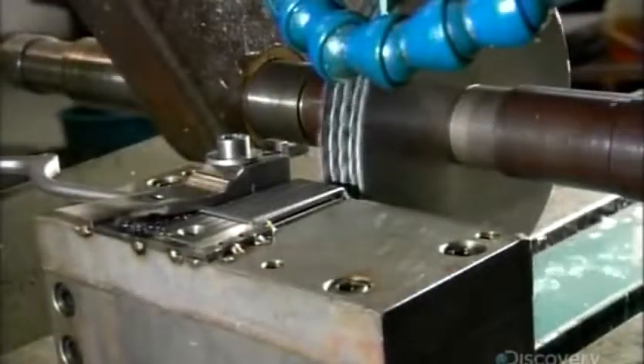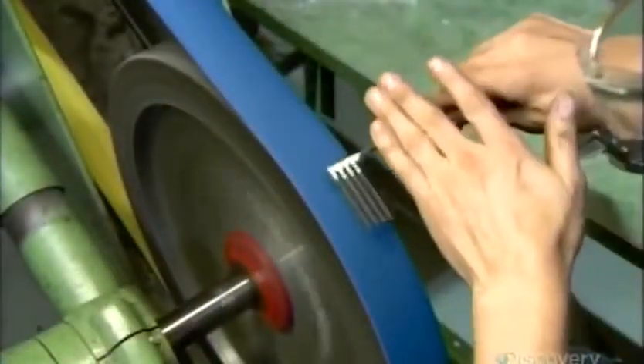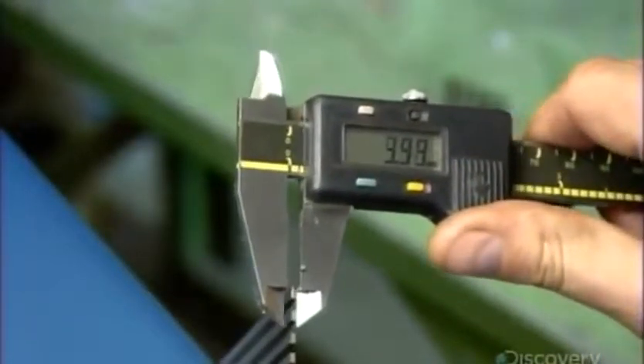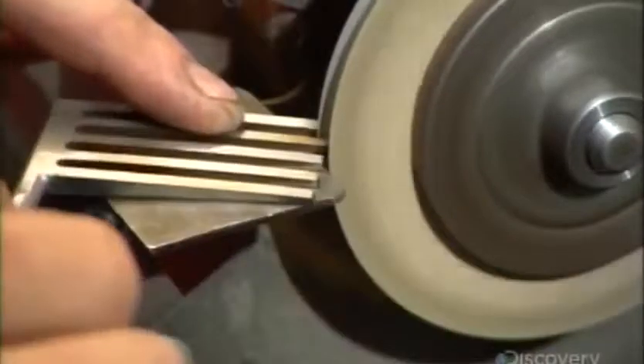Next, cutters carve slots in two parts to create the retractor's intermeshing jaws. These jaws will be used to grasp and retract body tissue so the surgeon can operate. A technician sands the teeth down to a precise size — he must be accurate within a quarter of a millimeter. He then smooths the jaws' teeth against a fine-grit wheel so they'll easily intermesh when needed. He rounds the tips of the teeth to make them blunt, so they won't damage human tissue.